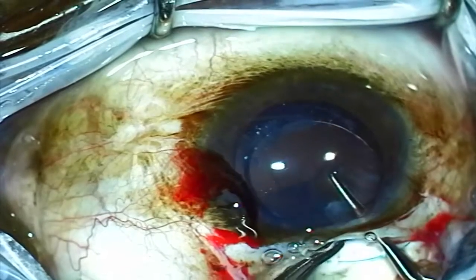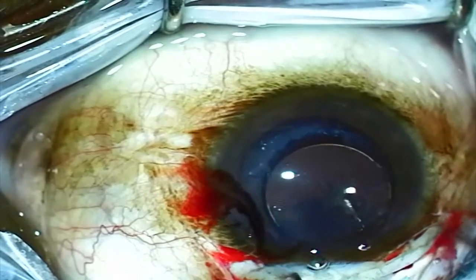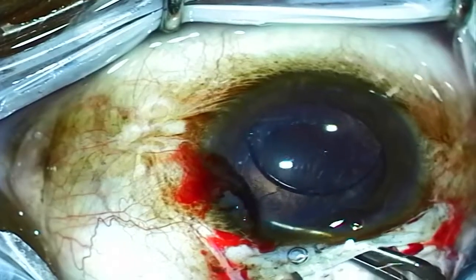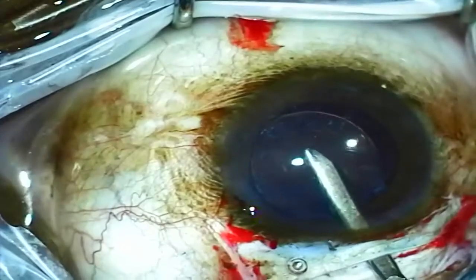Next, a three-piece lens is placed into the eye and the optic is prolapsed into the capsular opening.